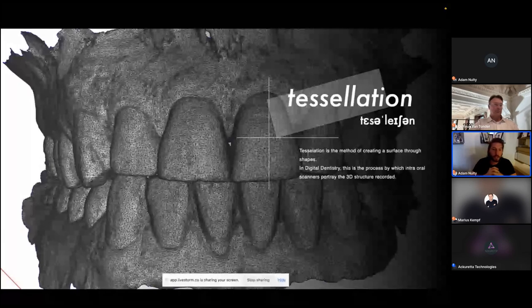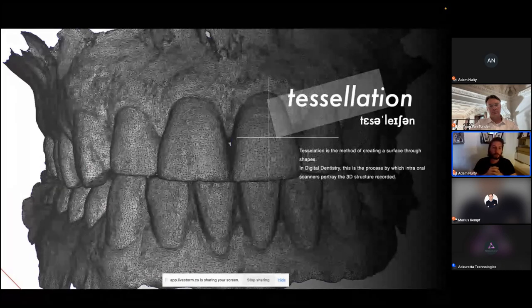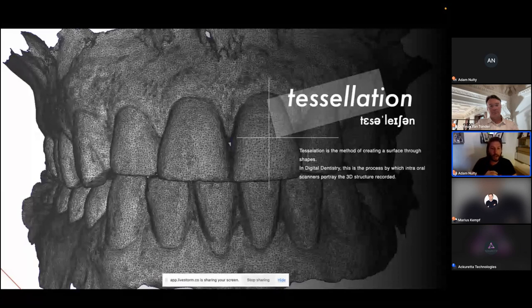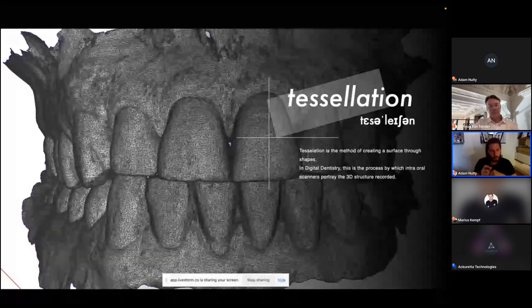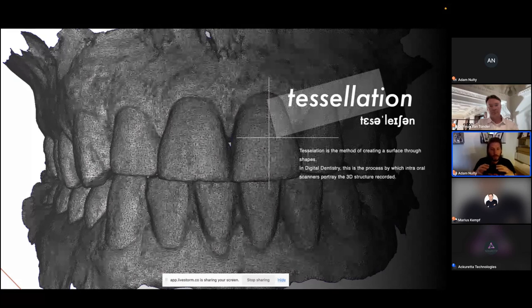So an STL, you can see if you look at this, this is actually an image of my teeth. These are my teeth that I've scanned, and you can see that it's made up of smaller triangles. So that piece of paper is actually made up of loads of little triangles that are more or less concentrated depending on how dense that surface feature needs to be. If there's more detail, there'll be smaller and more of the triangles. If there's less detail, then it'll be a flatter surface, and the software algorithm can produce fewer triangles to represent that area. When we look at color in scans, it's just the same as when we paint a piece of paper or color it in.